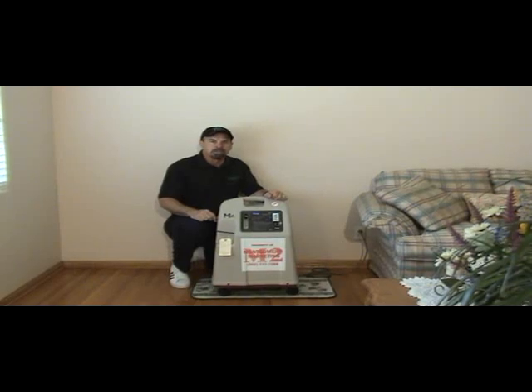Today we're going to do a general in-service on an oxygen concentrator. An oxygen concentrator filters oxygen from the room and delivers it to the patient at high levels or high concentrations, similar to what's in bottled oxygen. So if you're using an oxygen concentrator, you can be assured that you're getting medical grade oxygen to the patient.